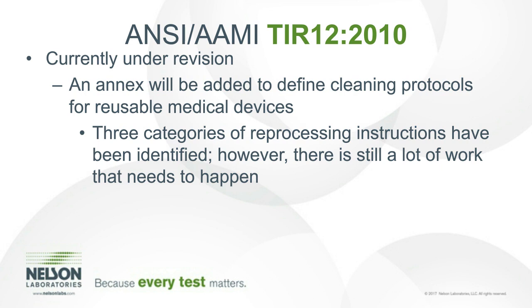What these protocols will entail is they will help eliminate all these different IFUs that are floating out in the industry and to harmonize them for one particular type of device. So far, a preliminary list has been identified where these devices have been categorized, and they have been 3 categories for reprocessing instructions. However, there is still a lot of work that needs to be done. We started off with 9, then moved to 7, and now we've come down to 3. But this is still very preliminary.